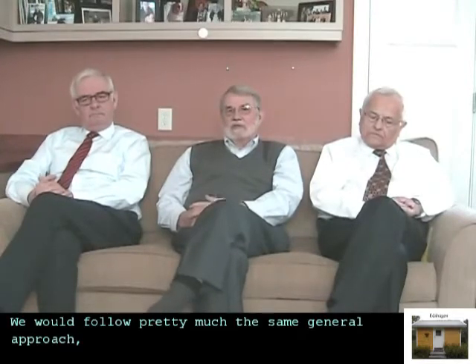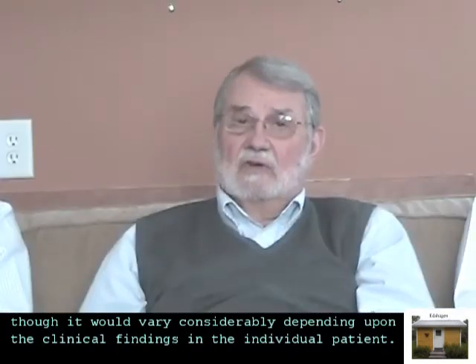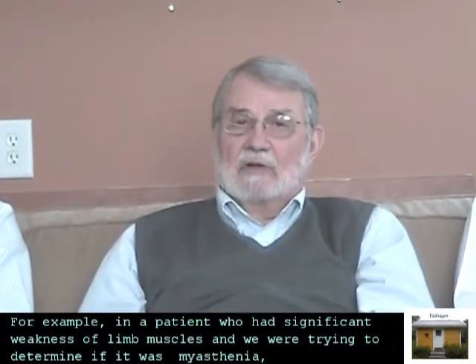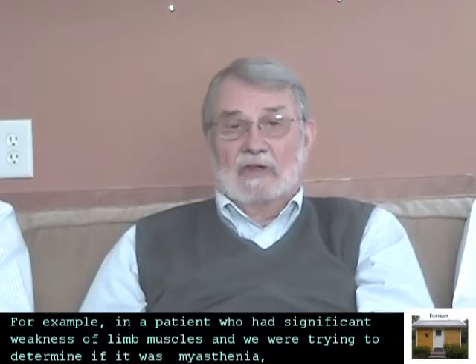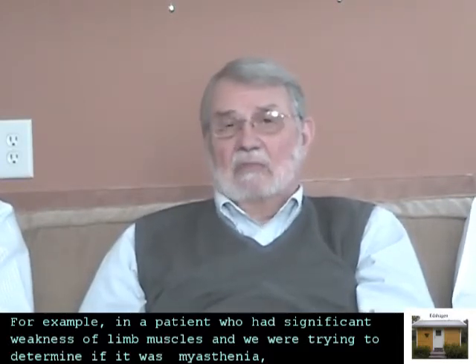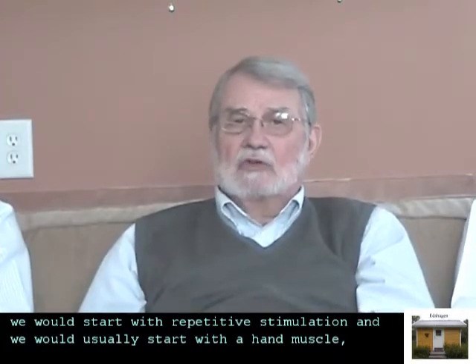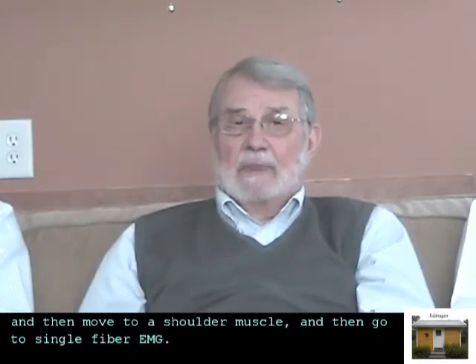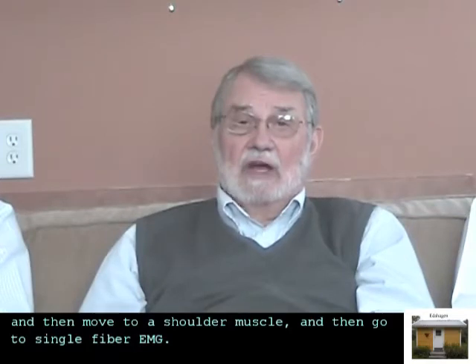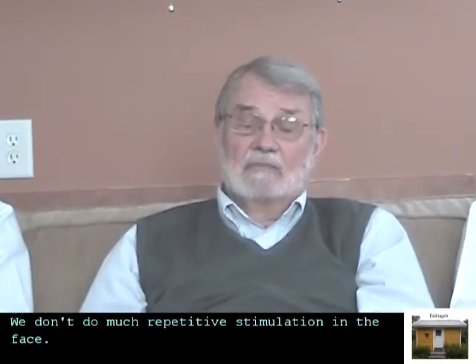We would follow pretty much the same general approach, though it would vary considerably depending upon the clinical findings in the individual patient. For example, in a patient who had significant weakness of limb muscles, and we were trying to determine if it was myasthenia, we would start with repetitive stimulation, and we would usually start with a hand muscle and then move to a shoulder muscle, and then go to single fiber EMG. We don't do much repetitive stimulation in the face.